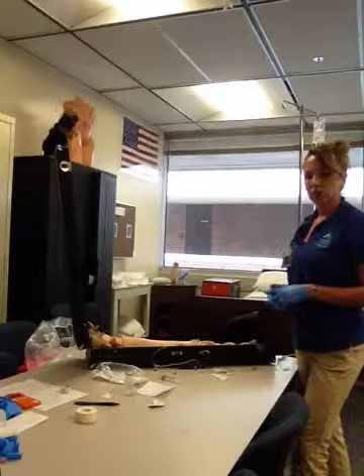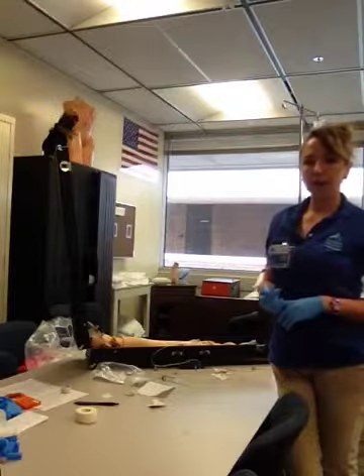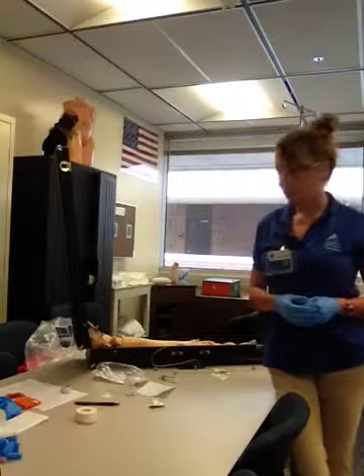I'm going to leave the room for 30 minutes until the infusion is done, and tell Mrs. White to call me if she has any problems or any drainage or pain at the site. Meanwhile, I'm going to document on my MAR the time, the date, the dose, the drug, and the route of what I administered. I'm going to state the condition of the IV site when I went in, that it was good. And after the infusion, I will record the volume amount on the MAR as well as on the input and output for the patient.